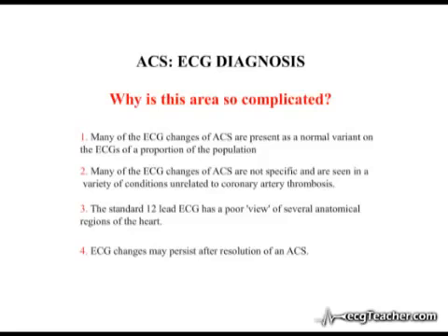Experience is king in this area, but you have to start somewhere, and the following videos give you a description of the ECG changes of acute coronary syndrome.